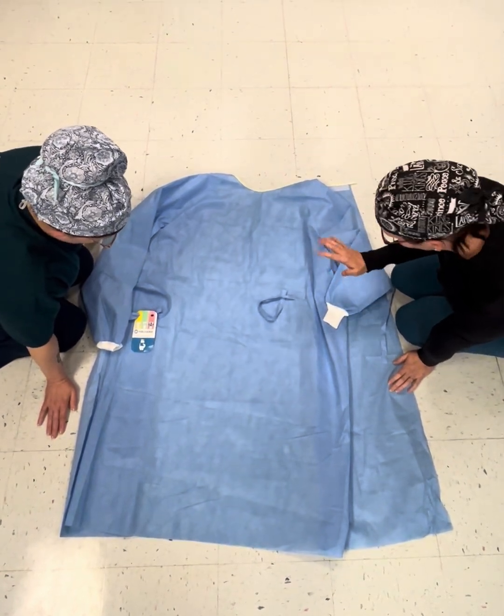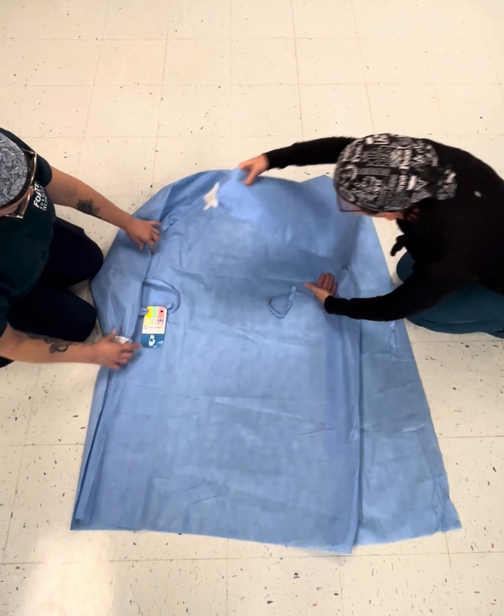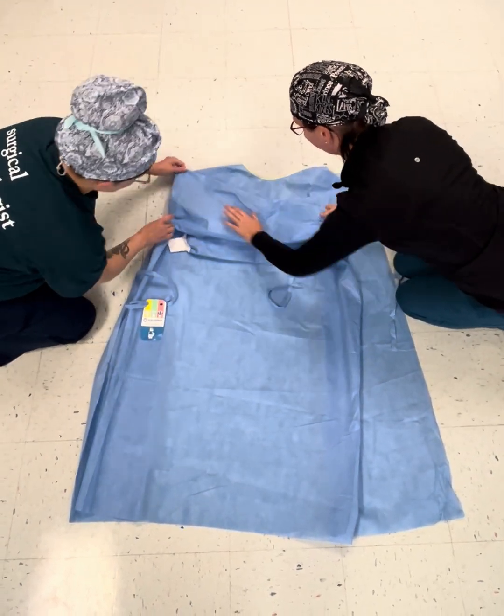Okay, gown folding video. Have the top of your gown up. We're going to fold our arms like we're giving ourselves a hug.